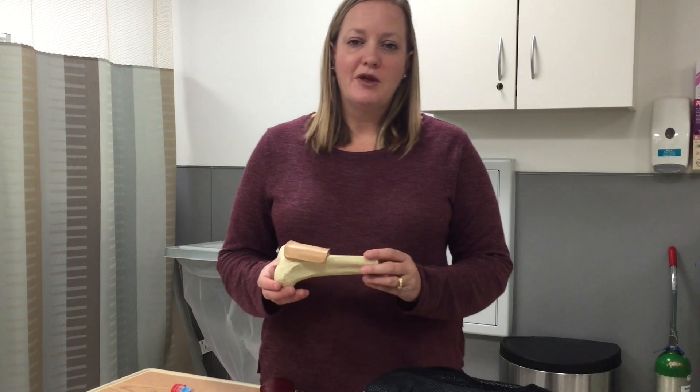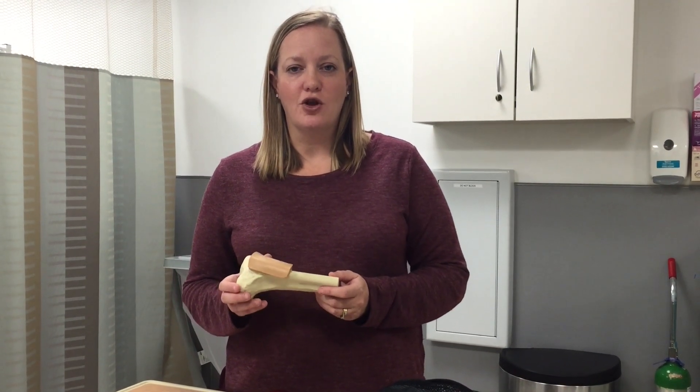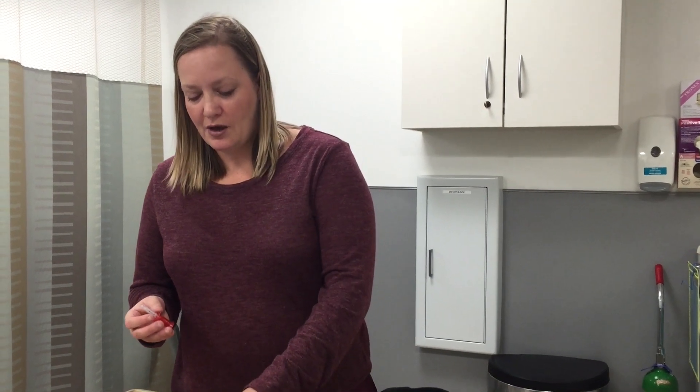The IO can be placed in adults and in children. It can be placed in several different areas of the long bone. Most commonly we use the proximal tibia. You can use the distal tibia. You may also use the proximal humerus, and you just want to find the flat portion of the bone. There are different size needles depending on if you are using a pediatric patient, an adult patient, or an obese patient, and this is the standard size needle for an adult patient.